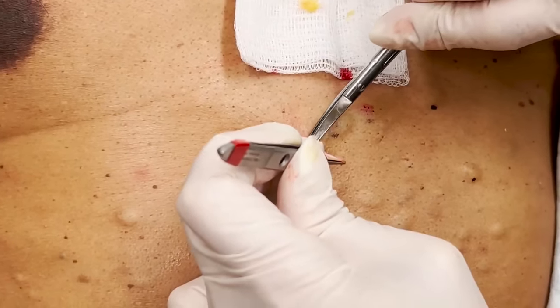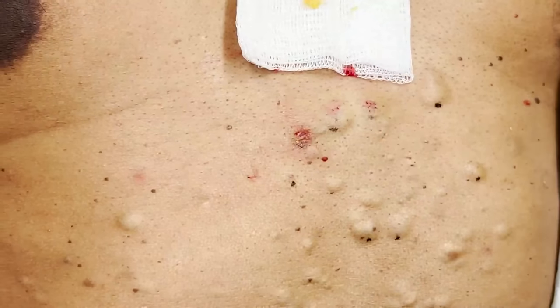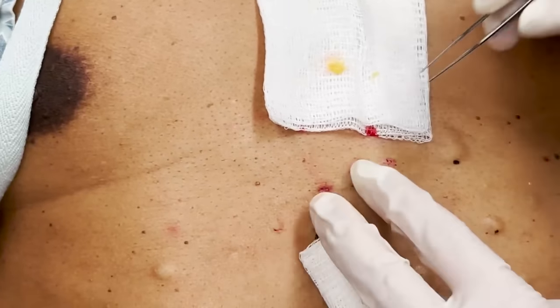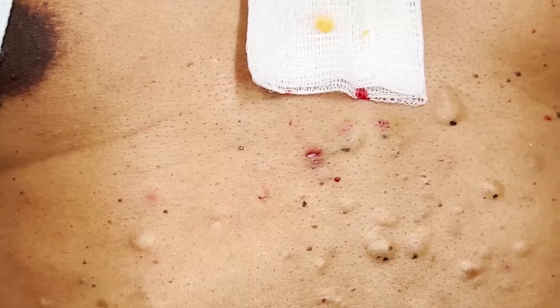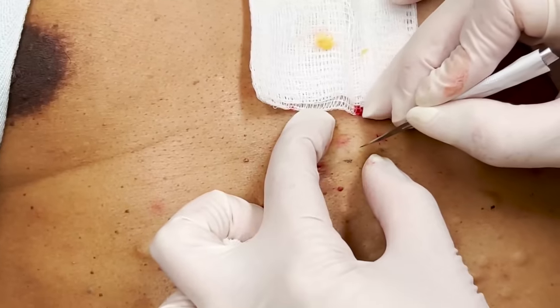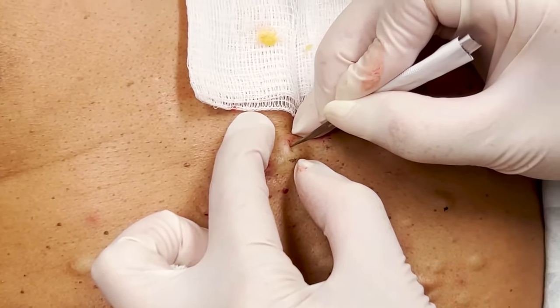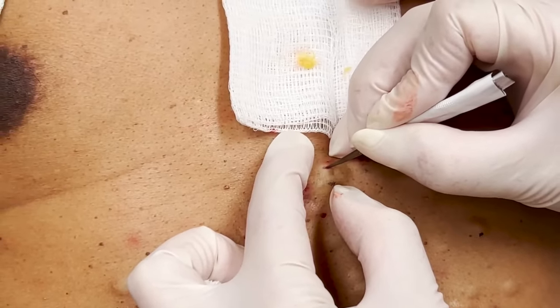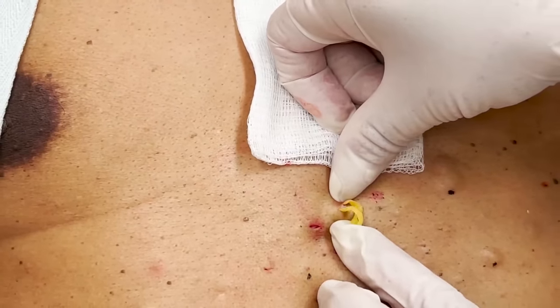So as you can see, I use these serrated forceps when I try to wiggle, because a lot of times a perfect size that's a little smaller than this will really pop out if you do a little wiggle. Moving right along. We're in that bigger cluster. You can sometimes see like the opening — in fact nothing comes out of it. It's almost like a pore. Since it's the oil gland it comes from, it's like that pore — the sebaceous unit.